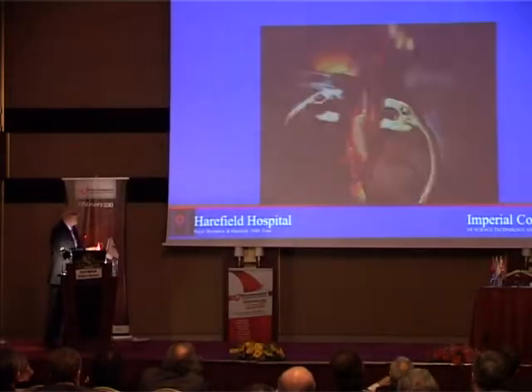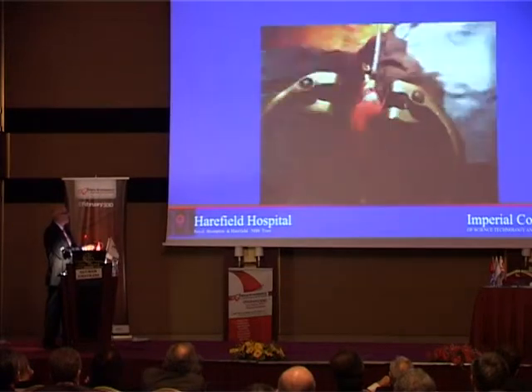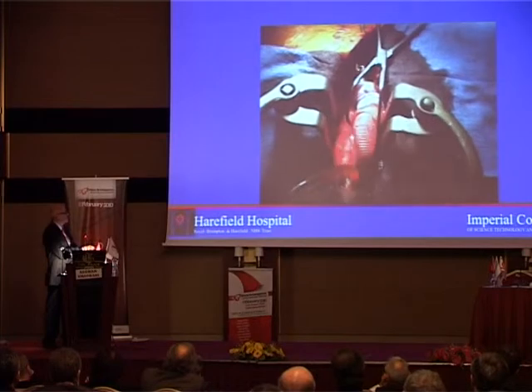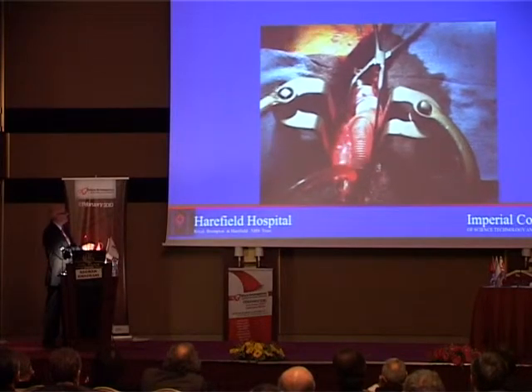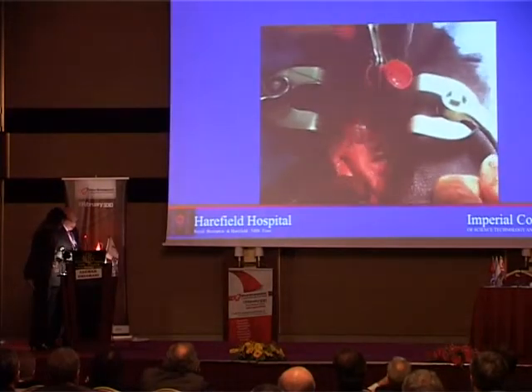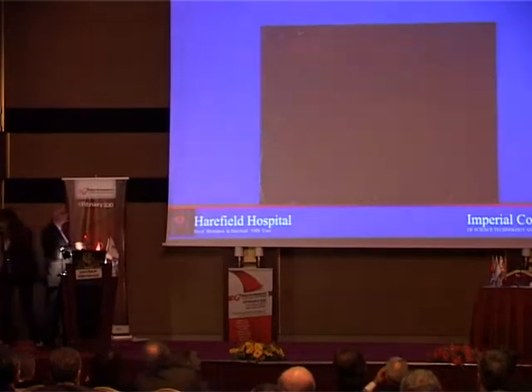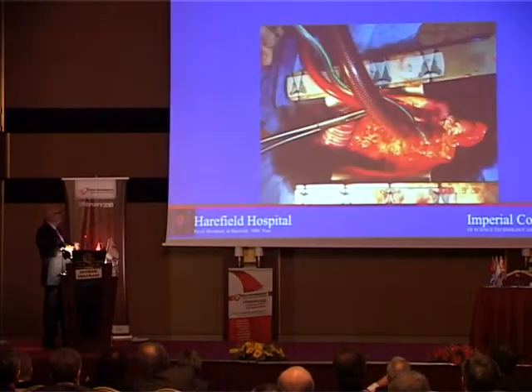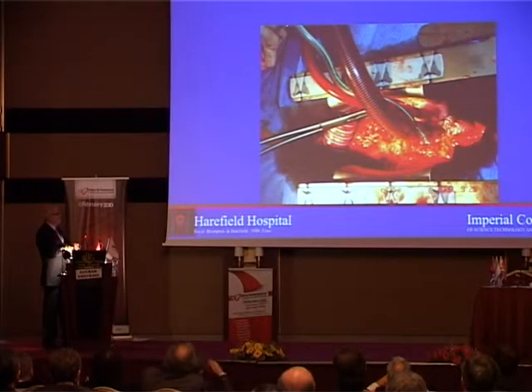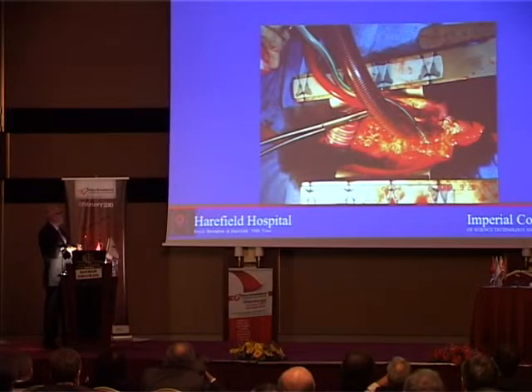Sometimes we need to go and open the sternum, but not mobilize the heart. Just because some patients have frequent line infections, we don't want to leave any part behind. So actually here, we are establishing cardiopulmonary bypass directly through this cannula to the aorta and the right atrium.